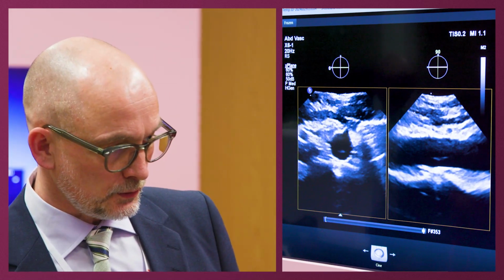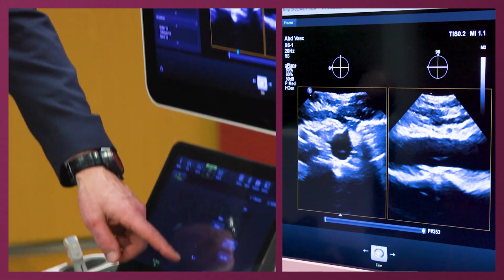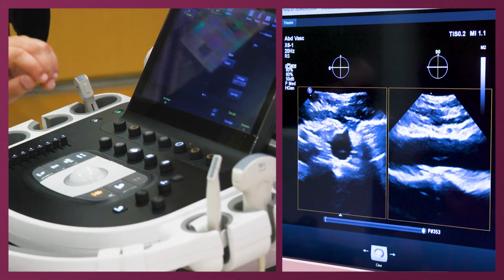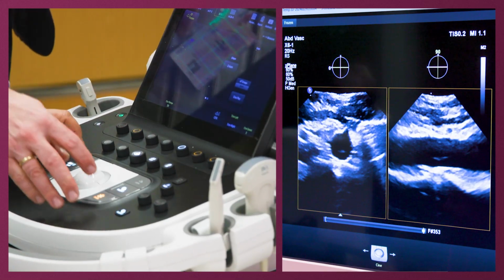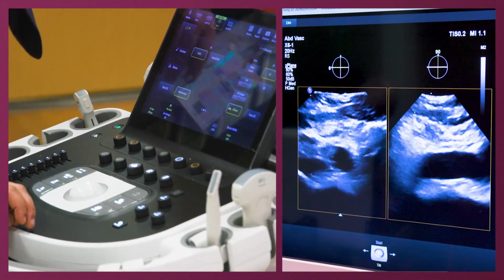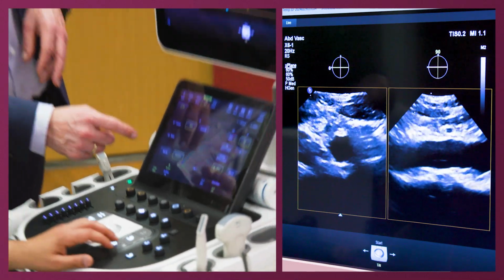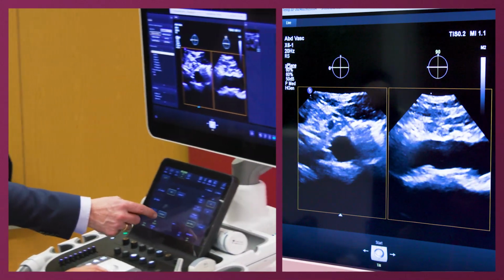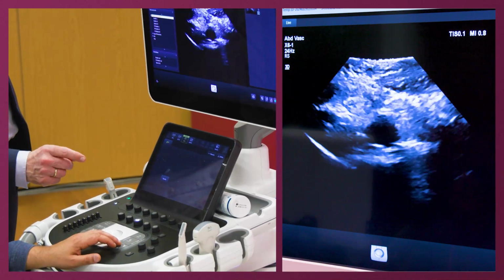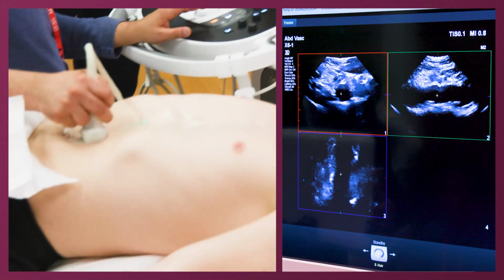Definitely. If you want to do 3D, you can. So now you have this on, and then actually in the Copenhagen business, we measure the diameters here and here. Save. Now you have to unfreeze, find a good image, make it perpendicular. We ask the patient to do a breath hold. Can you hold your breath, please? Hold it. Thank you. So now we can release pressure.